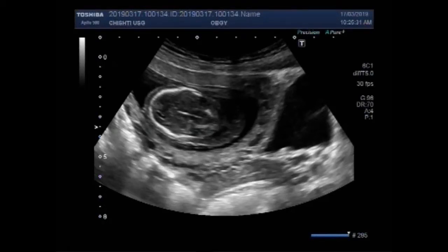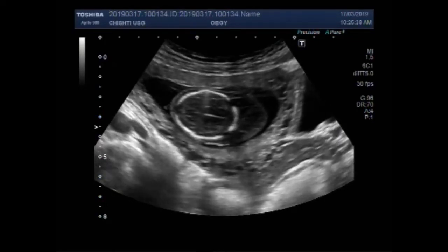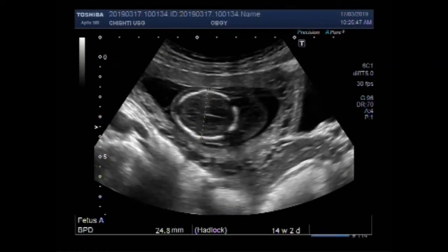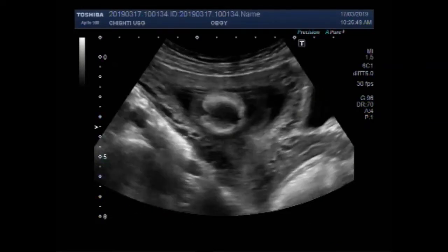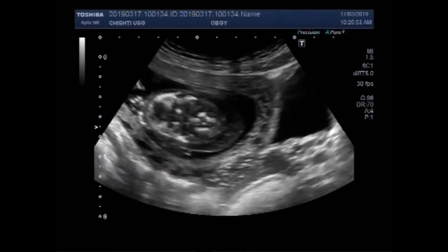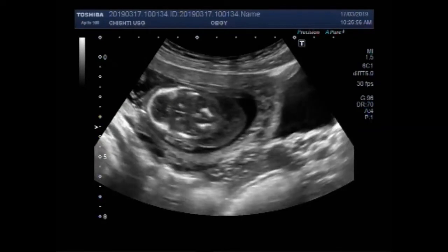Dear viewers, I hope you are all fine. This ultrasound video shows a fetus having fetal demise and a significant soft tissue edema around the fetal skull and the fetal abdominal cavity. You can see a significant soft tissue edema around the fetal skull.